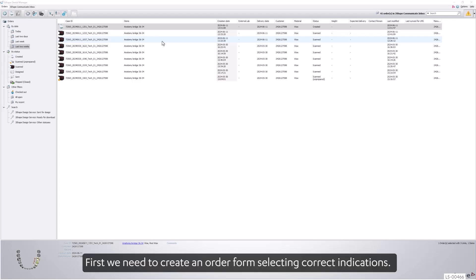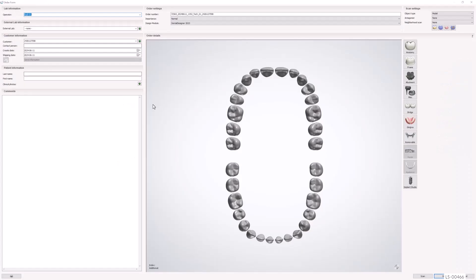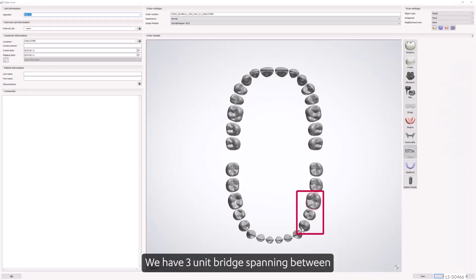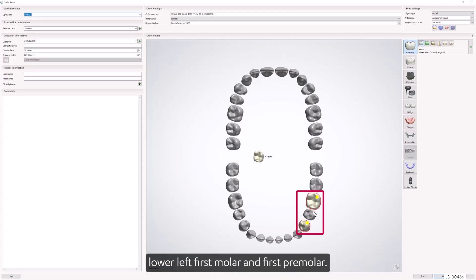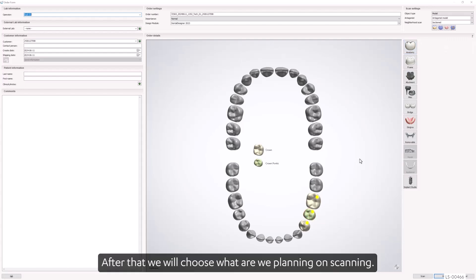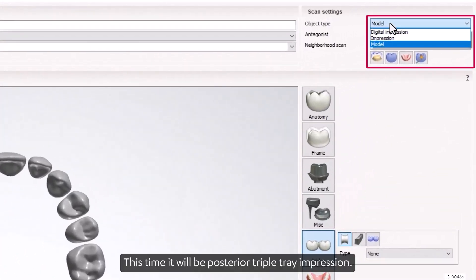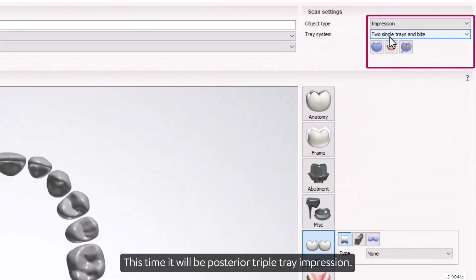First we need to create an order form, selecting the correct indications. We have a three-unit bridge spanning between the lower left first molar and first premolar. After that we will choose what we are planning on scanning — this time it will be a posterior triple tray impression.